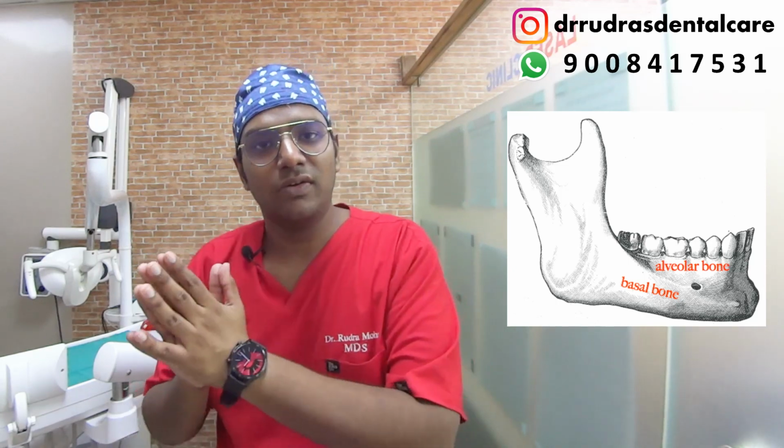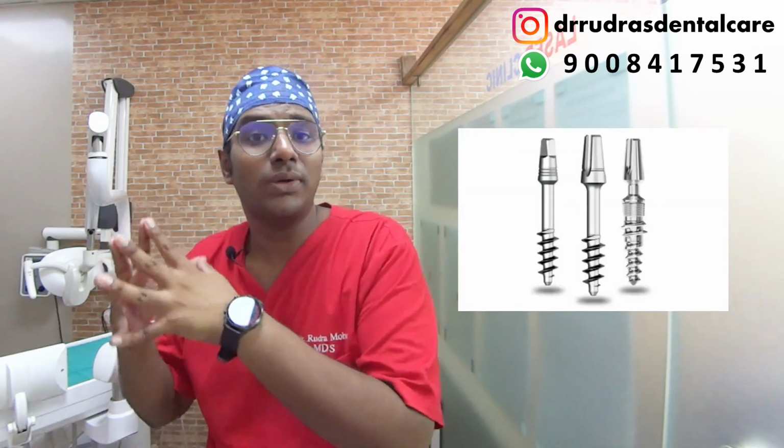Now because of that, in a lot of patients, conventional implants cannot be placed because of the lack of adequate width and length of the bone, and that's where basal implants come in. Now the basal implants engage the cortical bone, which is much stronger in density and does not get affected by metabolism or disease or pathologies or age or lack of use, because of which you get very good primary stability.